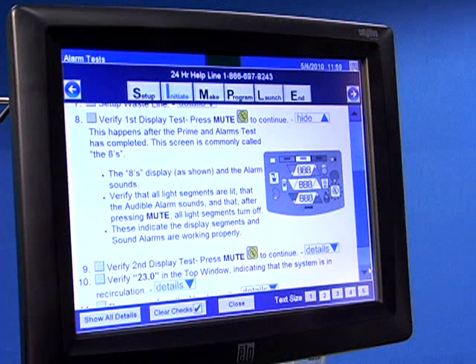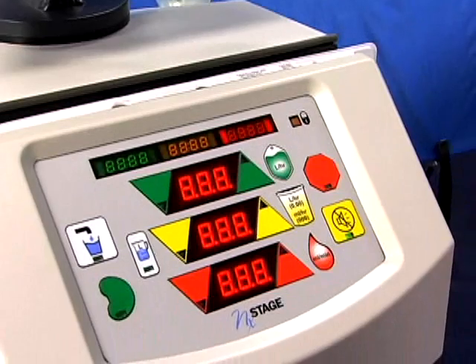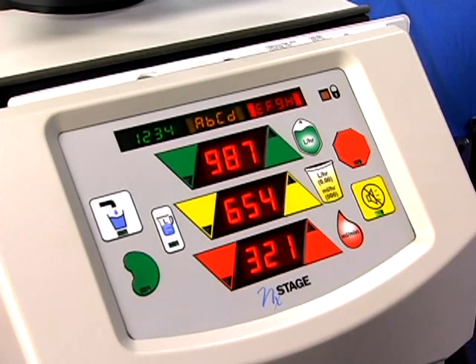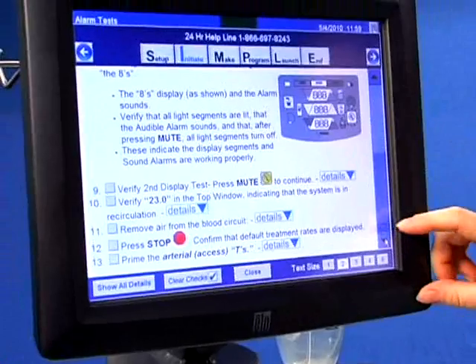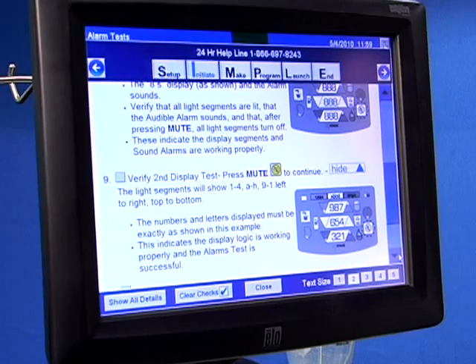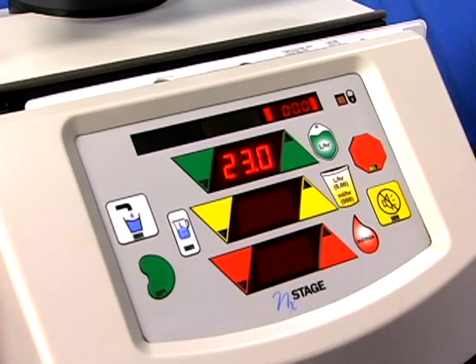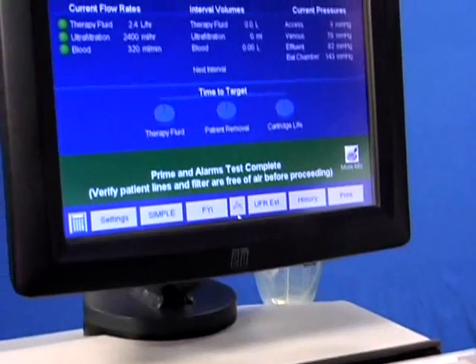Once the priming alarms test is complete, the machine will chime. You will then verify the first display test, the eights. If all the light segments are lit, press the mute key to confirm. The machine will chime again for the second display test. Compare the numbers and letters displayed to the picture in One View, Step 9. Press mute to confirm. Verify the 23 in the top window, indicating that the system is in recirculation.